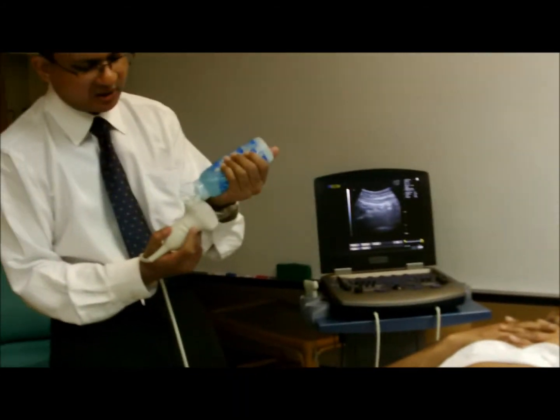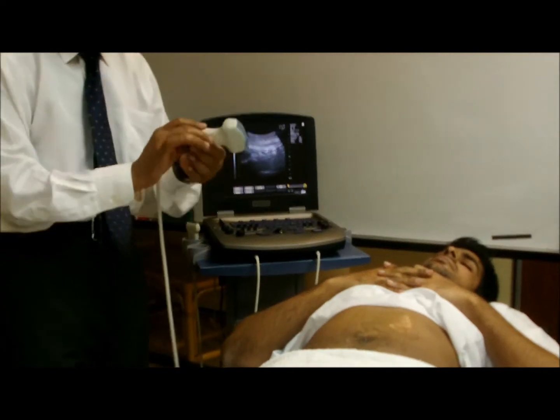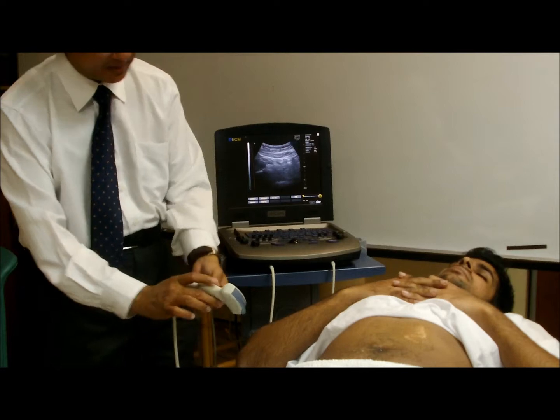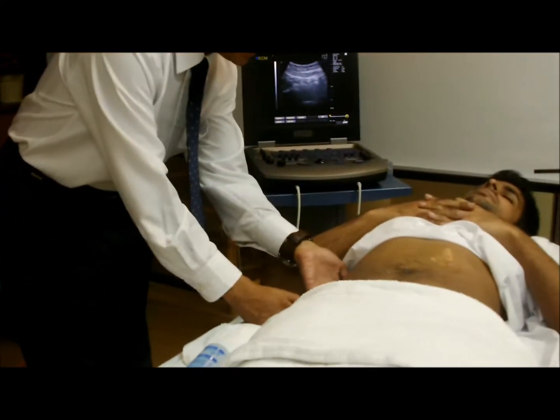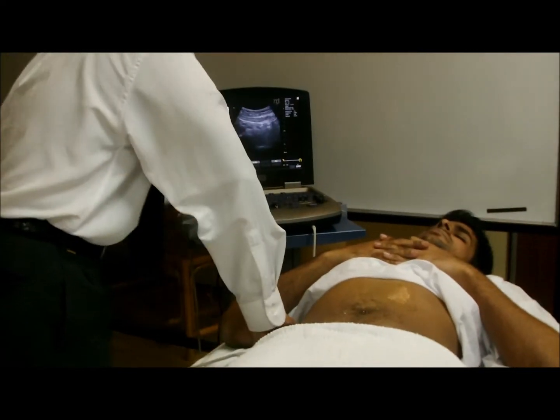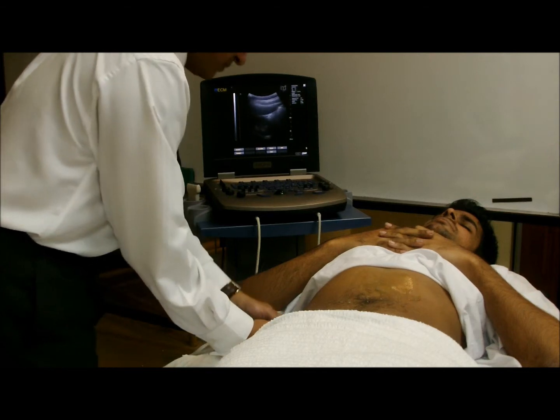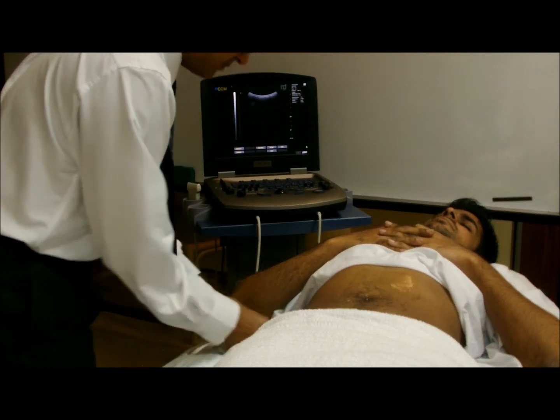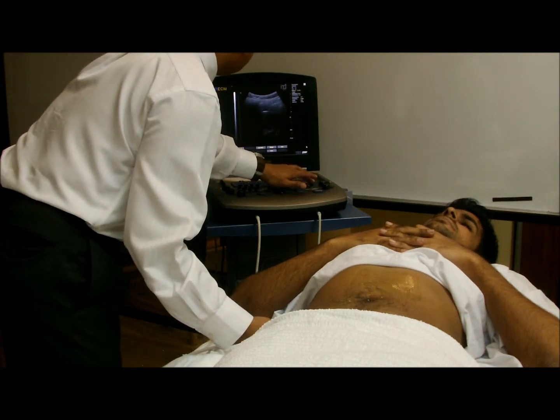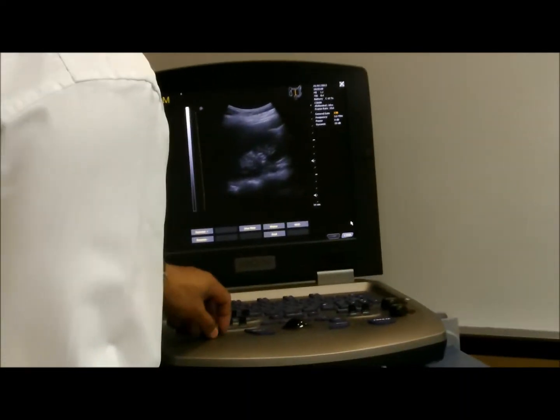If patient is complaining of that colicky abdominal pain, what you need to do is just put your probe with the arrow slanting like that towards posterior, and place it at the subcostal margin over the lateral chest or the lateral abdomen. Yeah. And from there you will be able to make out the kidney. Okay. So there you got your kidney.